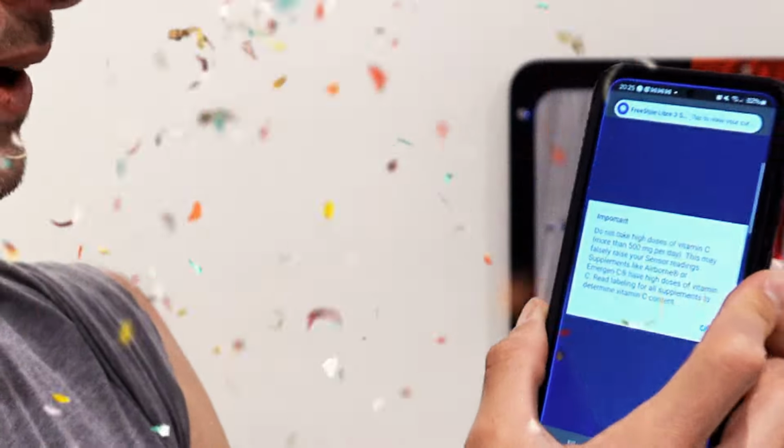Ooh, well that's cool. I've never had that before. Dexcom just kind of throws it to your phone. This actually connects, or requires a tap, I suppose. So it says, don't take too much vitamin C, and so on. Sensor ready in 60 minutes. Uh-oh, wait. I think I have to put it on before I did that, shoot.